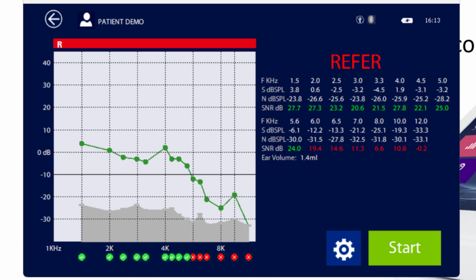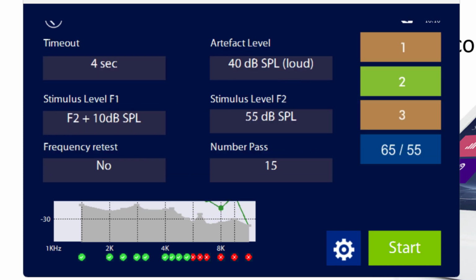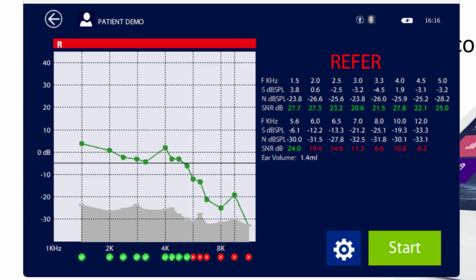What I could do is try a measurement on myself while I talk, but the talking is so loud that I need to be careful to do that during the calibration. So I'll try doing that with the screening protocol, but on purpose, I'll keep quiet during the calibration, and then I start talking during the measurement to show how it reacts to noise. It would be more ideal if someone else would make the noise, but let's see what happens.